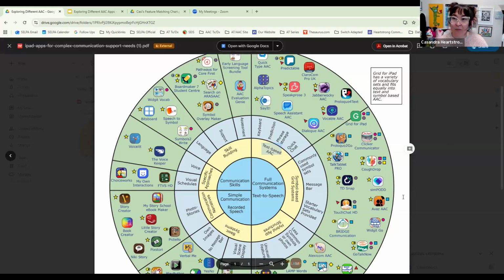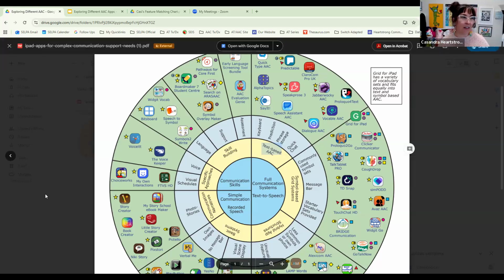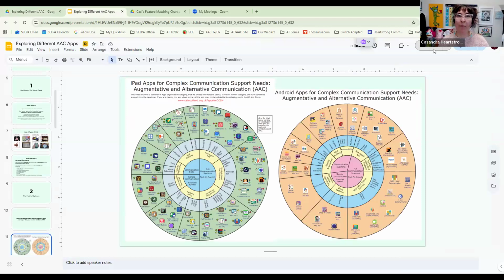Similarly, you're setting your students up for failure who are not literate with a text-based app. So that was just a little tiny look into why different apps are appropriate for different populations. There's a lot more to think about there, but that's just a really stark example that I think everybody can easily understand. So there are a ton of different apps, but the apps are made to meet the needs of different populations.